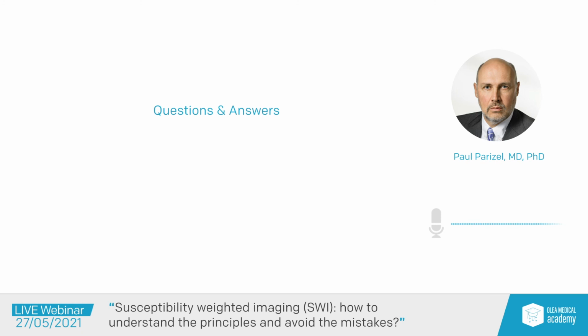That's a very nice link to the next question. That is, how comparable are the longitudinal studies? Is this a good technique to follow progressive disease?